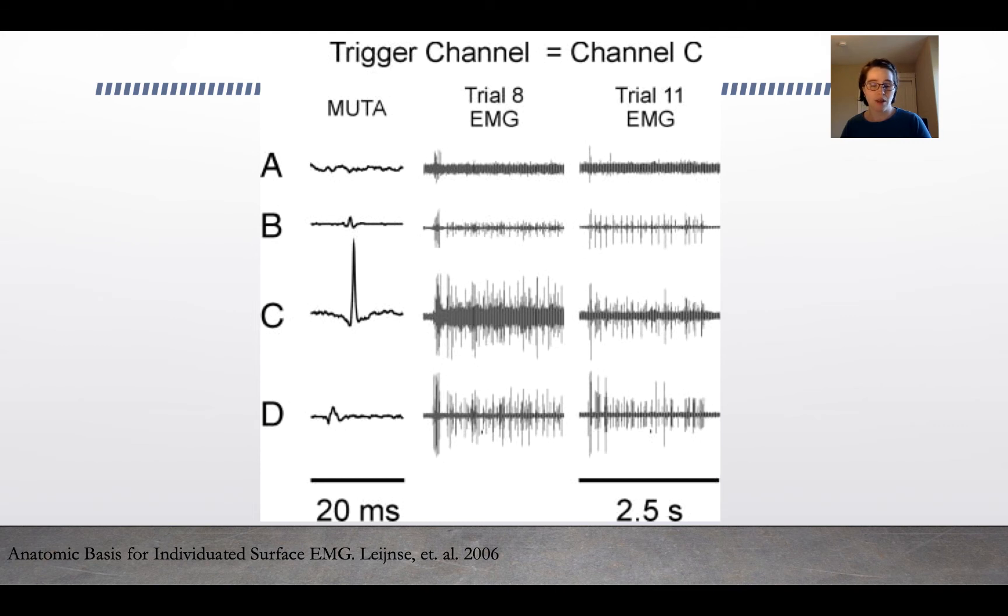There's not actually a lot going on in channel B. The leftmost column here is the muscle trigger, and trials 8 and 11 EMG are the signals being picked up. You can see that in B there's very little actually happening, but there's quite a bit of noise in trial 11, and that's probably due to all of the activity in muscle C. So crosstalk is a problem.